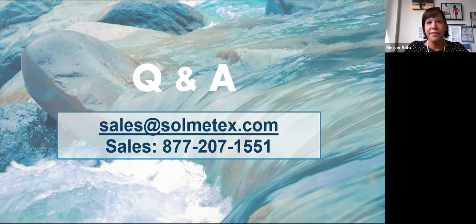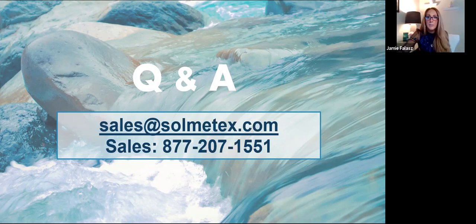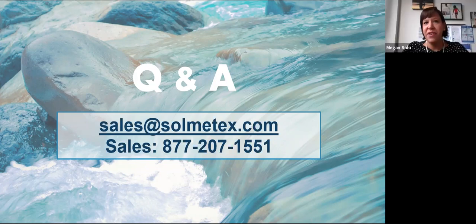All right, I'm trying to read this one. And this one relates to that. I'm exempt under the rule. Do I still have to have an amalgam bucket? Vacuum traps and chairside traps can still contain trace amalgam, so a bucket is a perfect solution to disposal. Always check with your local authority, as local governance and municipalities can have tighter regulations.